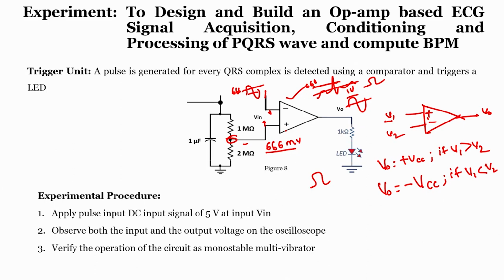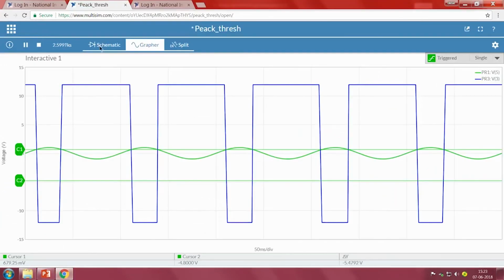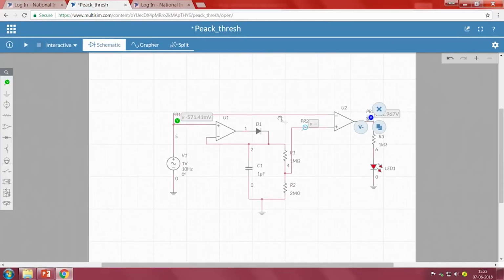So that means if I make this positive and this negative, right, then what happens, since it is 666 and this is the sinusoidal wave, so this is threshold, in order for V naught to become higher, the input voltage should be greater than the threshold value, only then it will become higher. Now just to see that, let me go to schematic, just to stop the circuit.